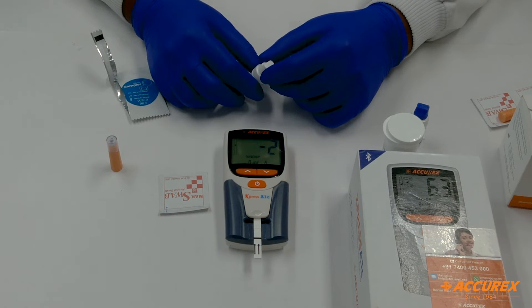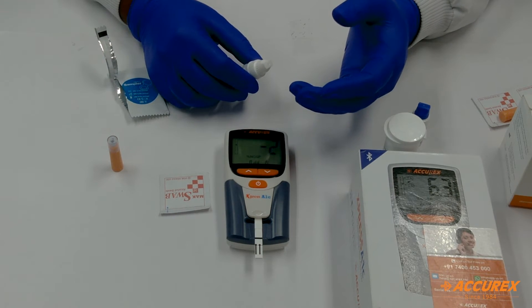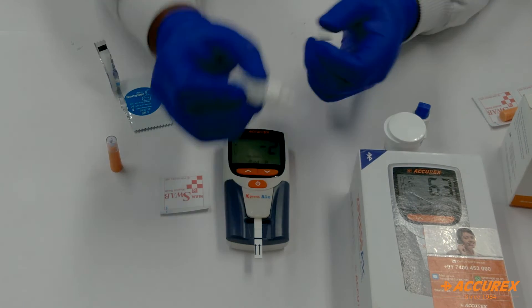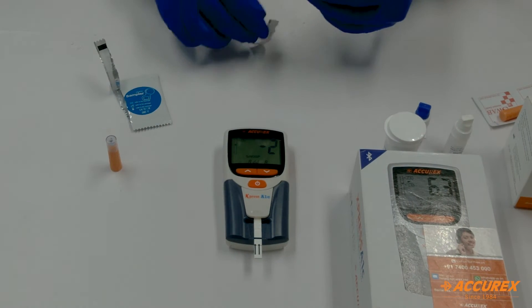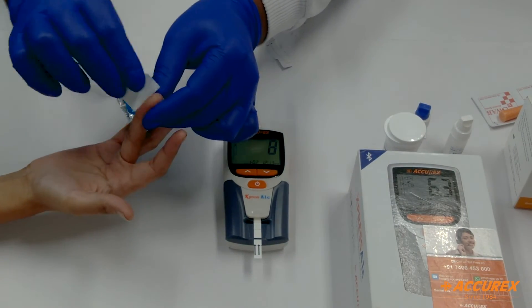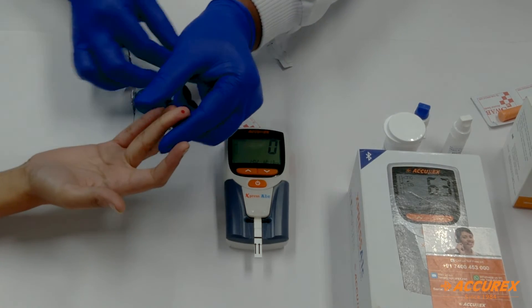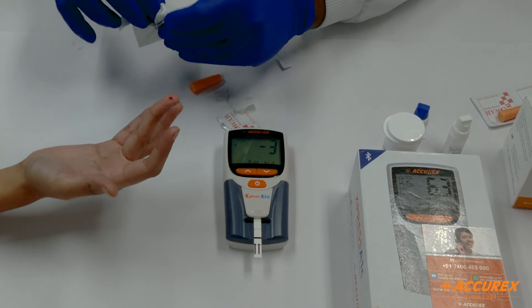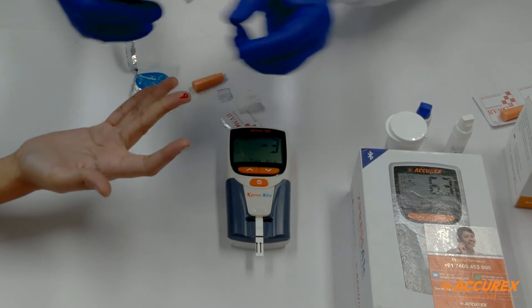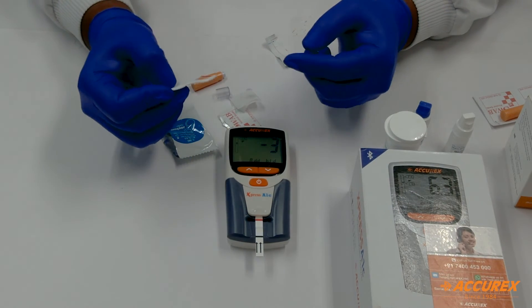The machine will keep on indicating what the next step in the procedure is. Now it is asking to add Buffer A — three drops. Add three drops: one, two, three. Meantime, pick the sample and keep the sampler ready for testing. Wipe the fingertip properly with an alcohol swab and prick it properly. Please apply the blood sample. Collect the sample so that the thread is covered with blood, and apply the sample to the strip. After that, the machine will start the countdown of delay time.